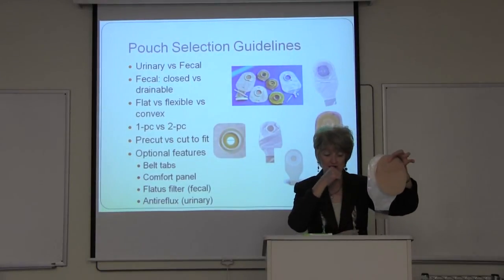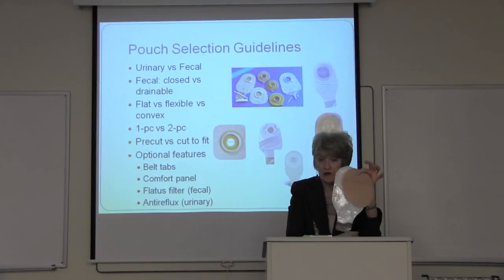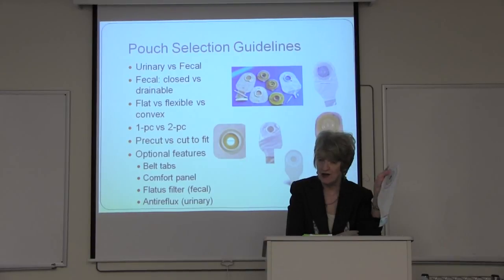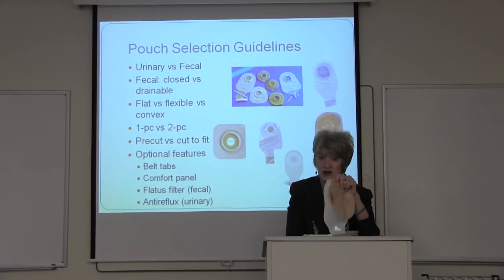I should mention that most of us in ostomy care believe that all patients with a fecal diversion should be taught how to manage a drainable pouch, because every patient with a fecal diversion at some point is going to have an episode of diarrhea, and they are going to need to use a drainable pouch for that period of time.